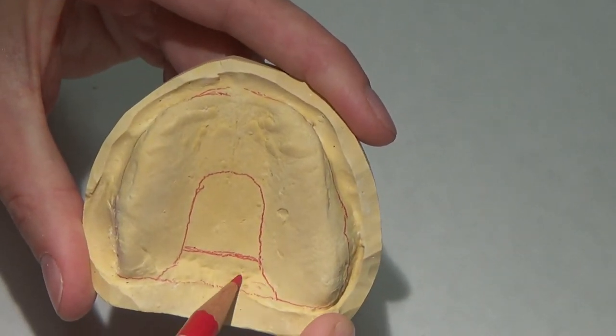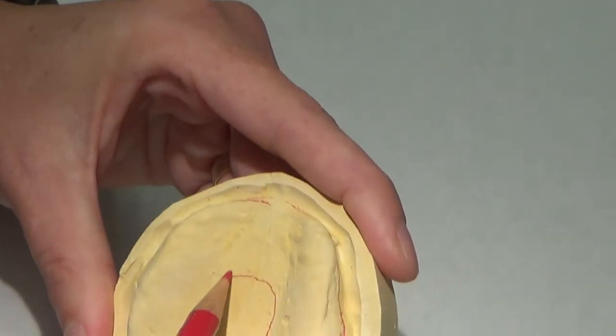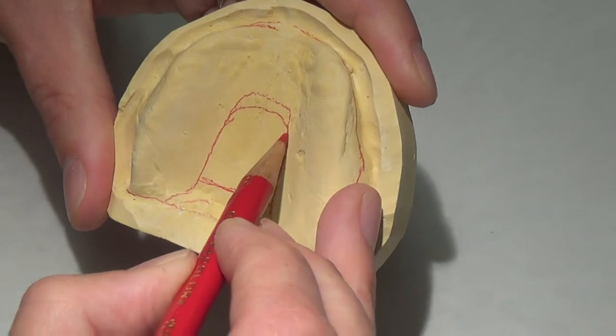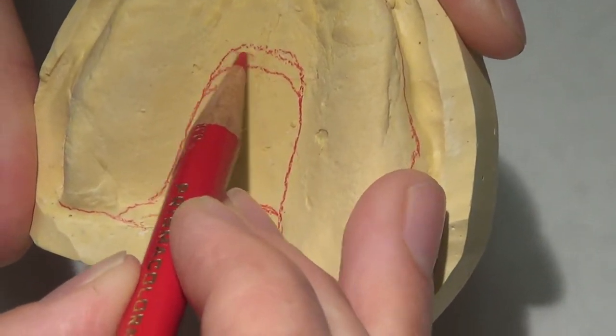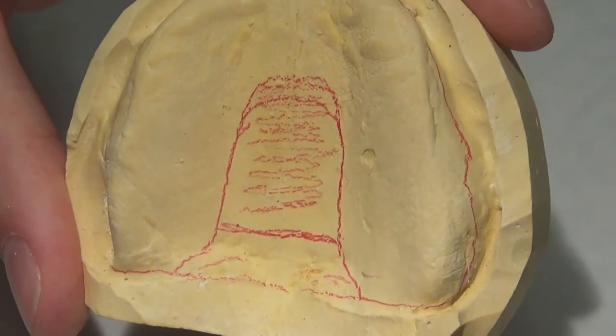This is actually a good example of a patient that I may do the stop. Because of these angles here and this kind of funny anatomy that she has, I'm probably going to make my stop in the center like the one in our lecture today where I don't actually extend it to the posterior border.